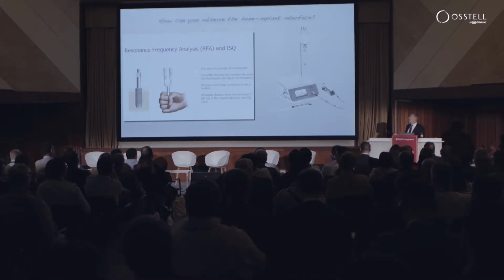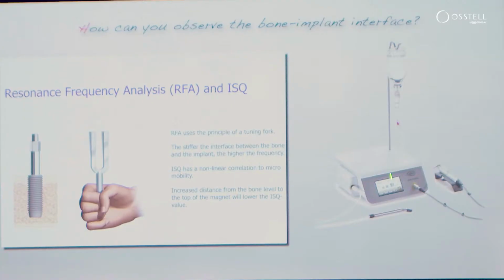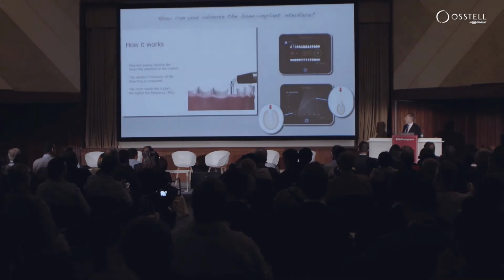These are old and sort of famous illustrations showing the smart peg and how it acts like a tuning fork on the implant surface. I have this unit now, which is a drilling unit combined with an Osstell device or an ISQ unit, although mine is reversed, that allows me to do this very efficiently every time I place an implant now. So all my instruments are together. I have the handpiece, I have the Osstell. Every implant I place now gets checked, and it gives me information that I'll show you in a second.